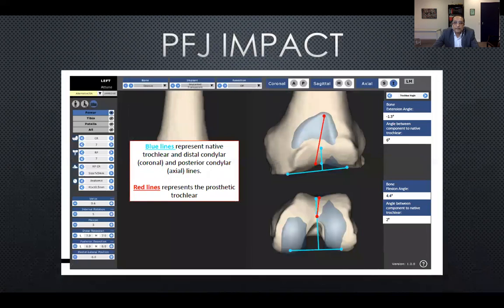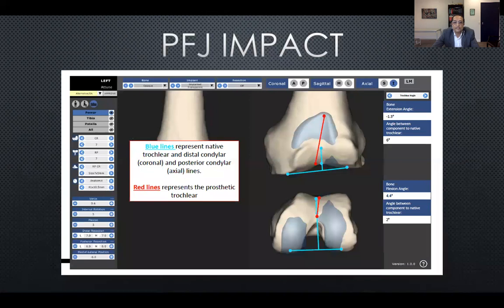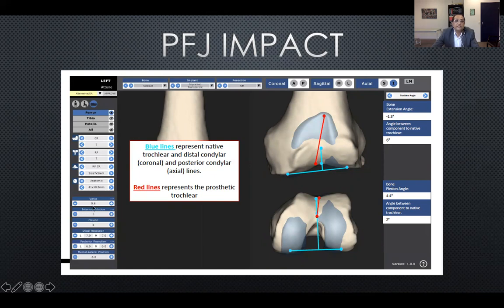Looking at the patellofemoral joint impact of trochlear angle to DFA and to PCA, I'm using software to preoperatively compare native versus prosthetic trochlear angles. The blue line represents the native trochlear with distal condylar coronal and posterior condylar axis lines, while the red line represents the prosthetic trochlear. The active screen allows changes to various distal femur or tibia parameters. In this example, the distal femur is at 0.6 degrees varus with five degrees internal rotation and a flexion angle of three degrees.